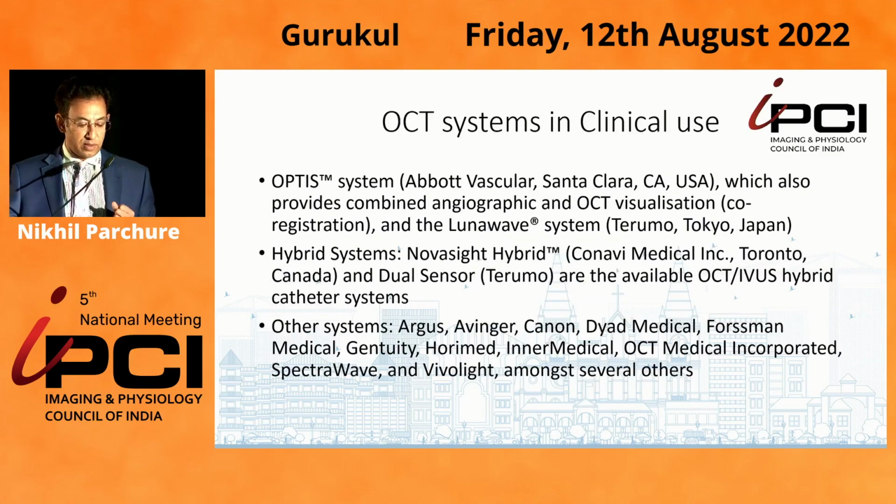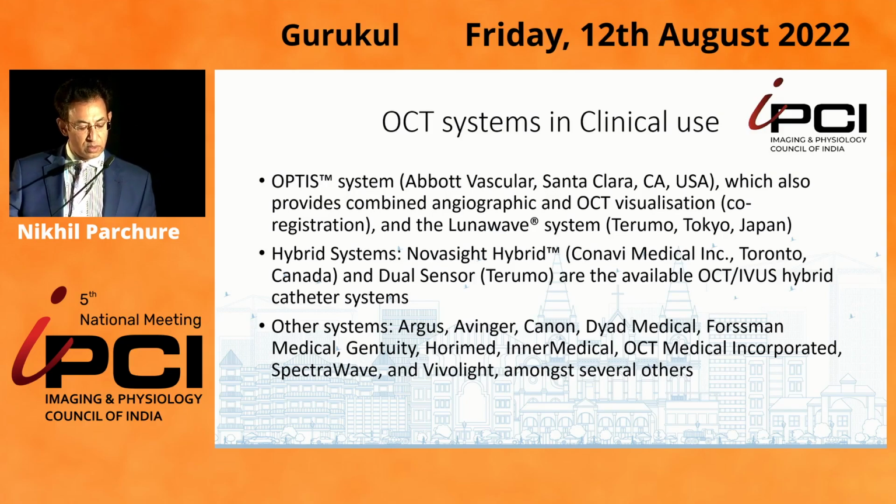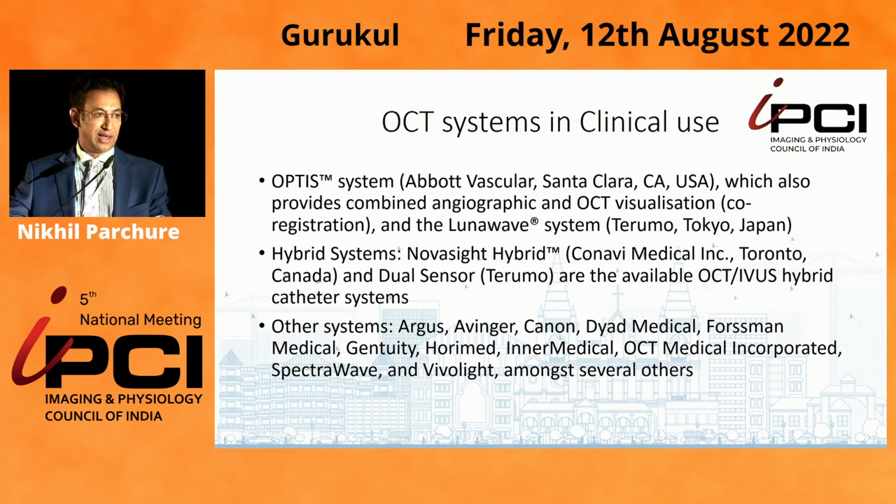This is very exciting, that there are many OCT systems in clinical use and more going to come in future. But at the moment, there is the Optis system from Abbott, which also provides combined angiographic and OCT visualization called co-registration, and the LunaWave system from Terumo, Tokyo in Japan, which is exclusively being used in Japan at the moment.